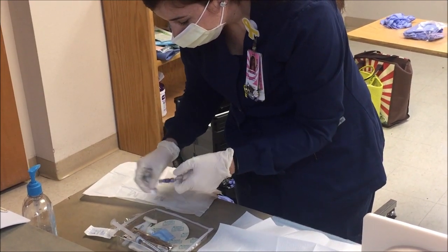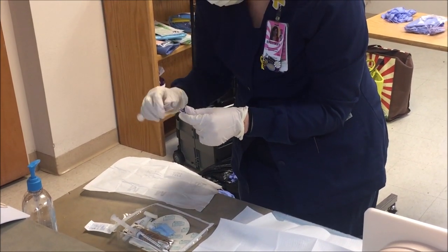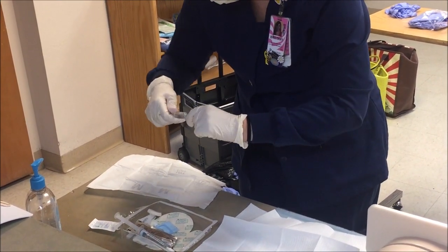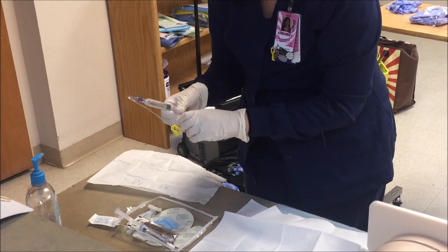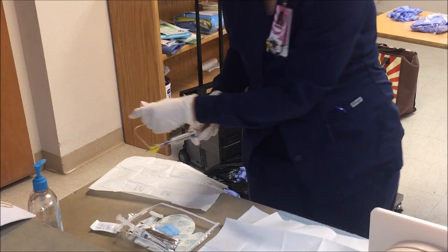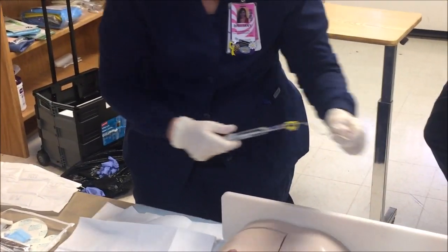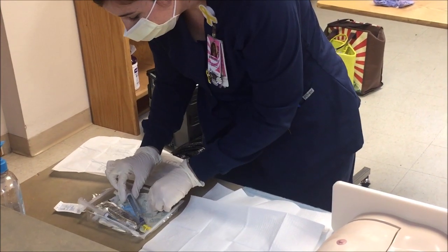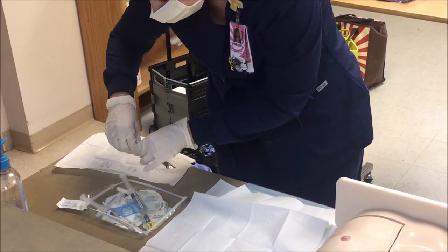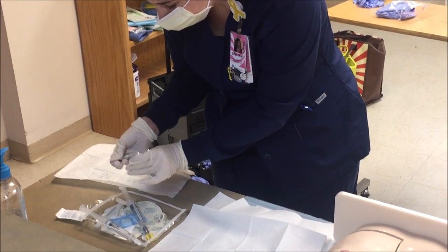Pick up your sterile normal saline syringe that comes pre-filled from pharmacy and attach it to your Huber needle and flush off to the side, away from your sterile field. There is a protection over the actual needle itself that keeps you from being stuck at this point. You can then return the Huber needle to the sterile field, as now you are ready to prepare the site.